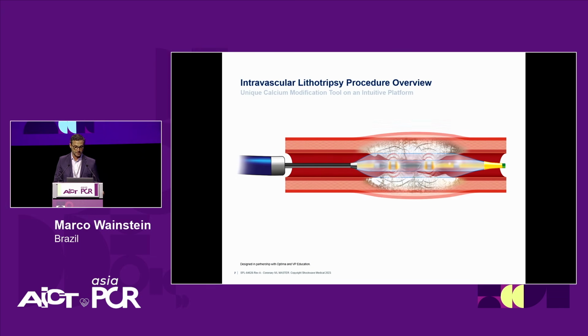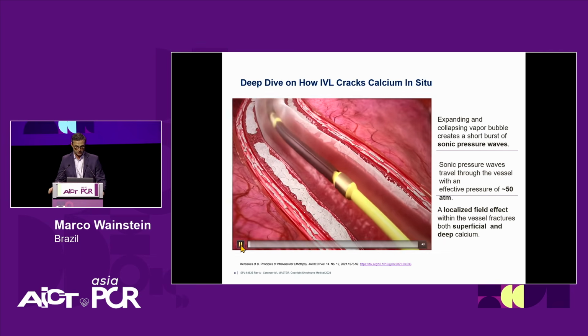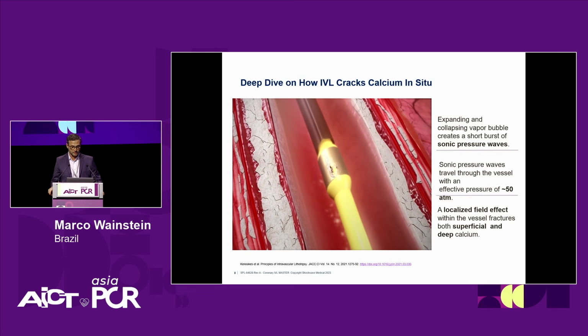And basically, this is a cartoon that shows the intravascular lithotripsy procedure overview, but you can see better in this animation here. Unfortunately, the sound is not going on.